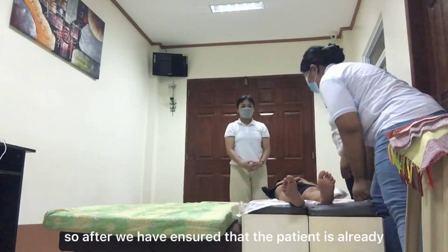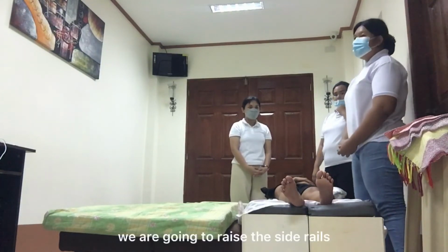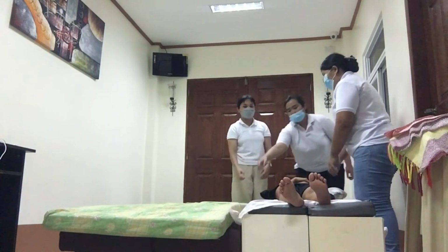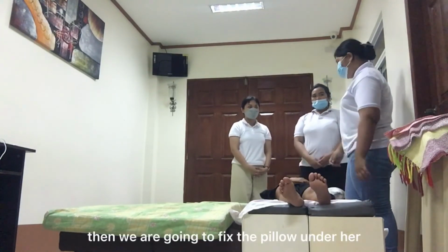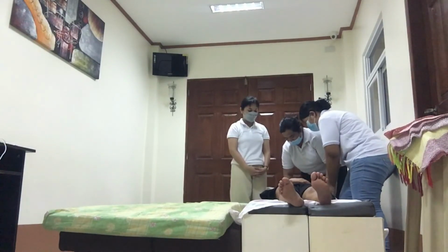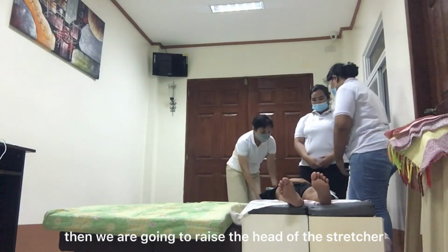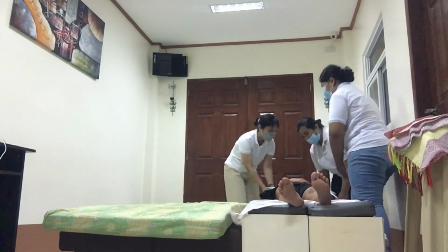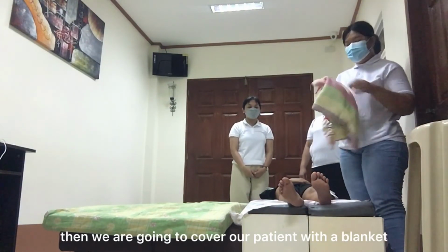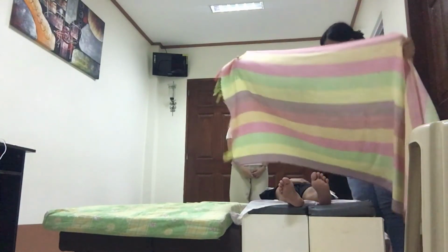So, after we had ensured that the patient is already in the center of the stretcher, we are going to raise the side rails. Then, we are going to fix the pillow under her head. Then, we are going to raise the head of the stretcher. Then, we are going to cover our patient with a blanket if necessary. Let's put a blanket on you.